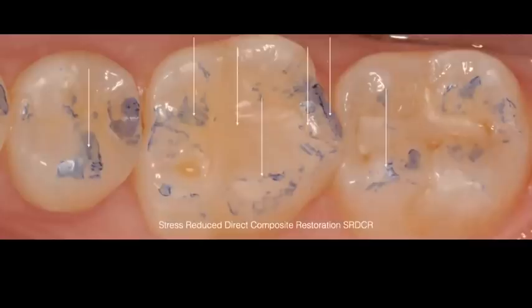So again, what we're going to do is build this composite based on the stress-reduced direct composite restoration concept developed by Deliperi and published in the literature. It is really more of a layering technique that reduces the amount of stress built up on the composite while you're polymerizing. That is why, for cases like this, large class 2s, we want to combine a centripetal and a successive cusp buildup technique.